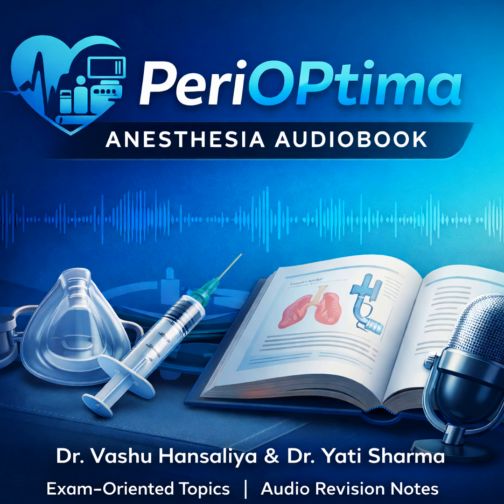Okay, let's discuss the inevitable adverse events. We need to know the most common complications and, more importantly, how to prevent them. The most common complication, and one you must cite accurately, is post-operative sore throat. It affects a considerable 17% of LMA users. That's a stark contrast to the 3% you see with a face mask.